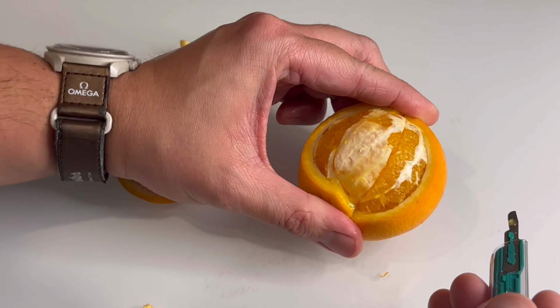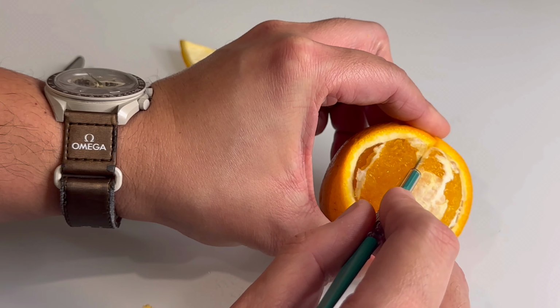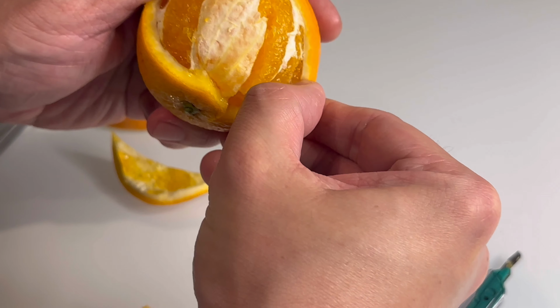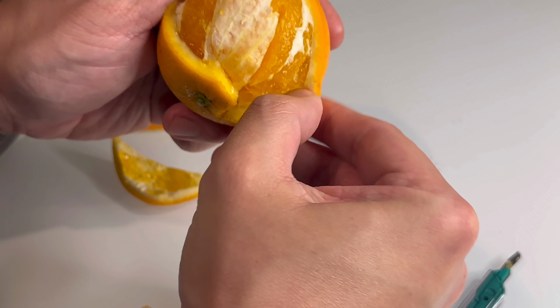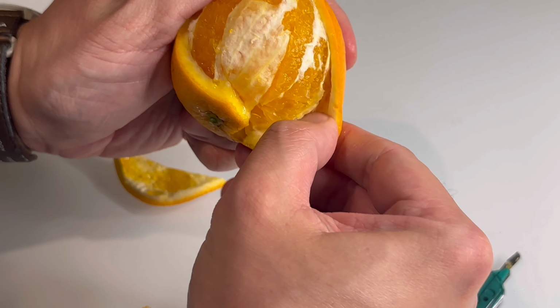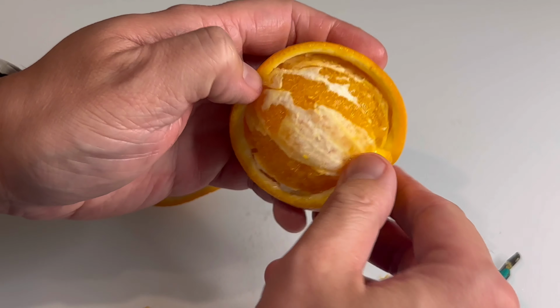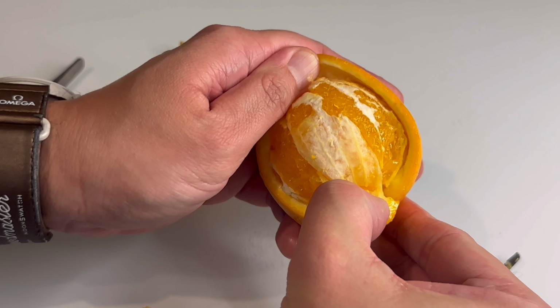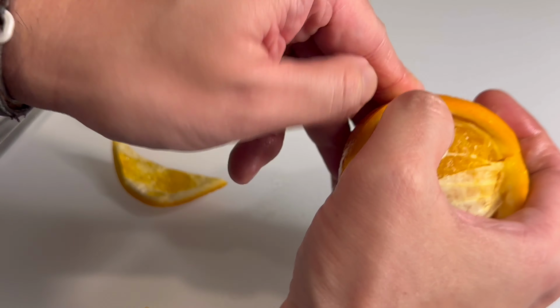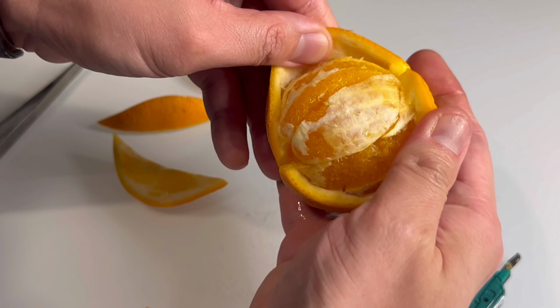Now that we've peeled this orange, you could see there's going to be planes in between, and then you can actually dissect them as well. And you can continue to dissect here as I push down. And when you're doing this, this is actually pretty good when you're bluntly dissecting tissue planes for mobilizing your colon, excising lipomas, and it's the same thing, understanding retracting on one hand and dissecting inferiorly. And so there's always going to be two parts of it.